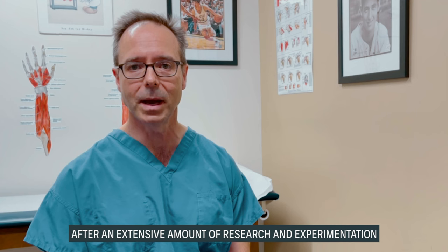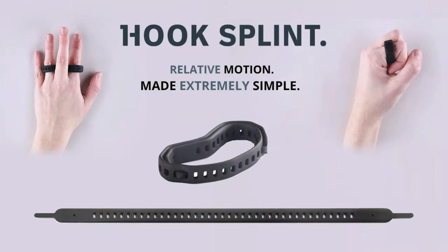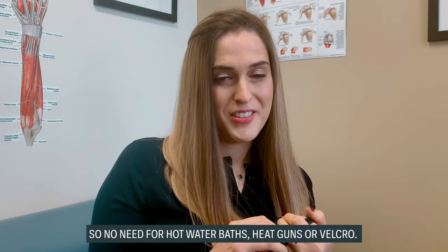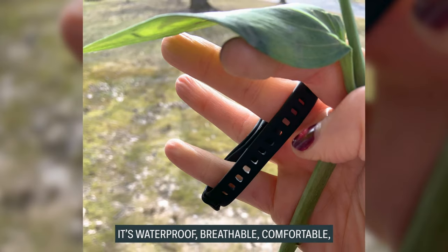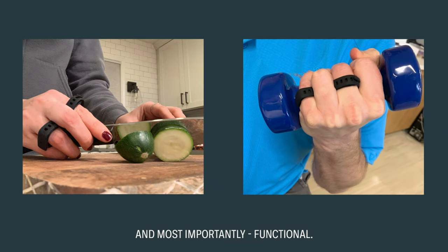After an extensive amount of research and experimentation, we are pleased to present the patent-pending Hook Splint. There's no need for hot water, baths, heat guns, or velcro. It's waterproof, it's breathable, it's comfortable, and most importantly, it's functional.